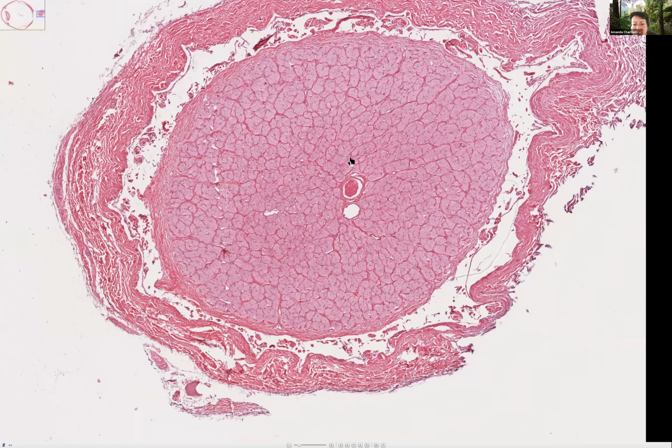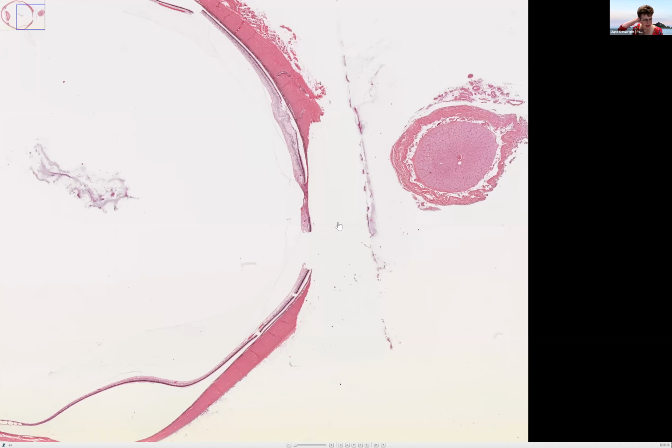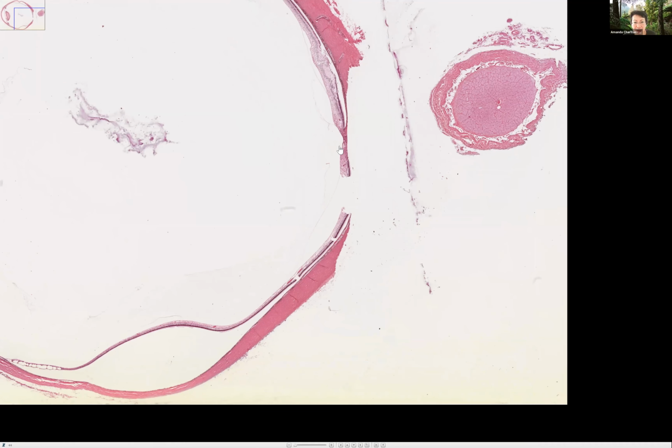Yeah. This looks like the artery to me. It's got a thicker wall and a muscular wall that's all together. Central retinal vein occlusion, so that's the vein. I think we'd expect to see a lot more hemorrhage, wouldn't we? We would. It would be very much more congested and hemorrhagic. Yeah. Red all the way around here with extravasation of red blood cells, which would correlate with what you see clinically, right? It's really hemorrhagic and red. And this one here would just look pale.